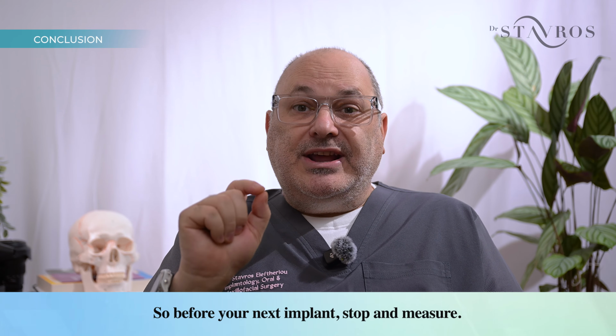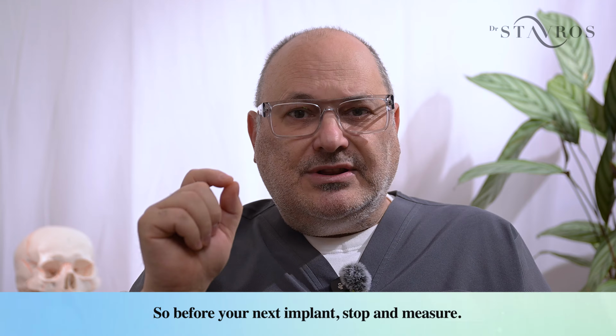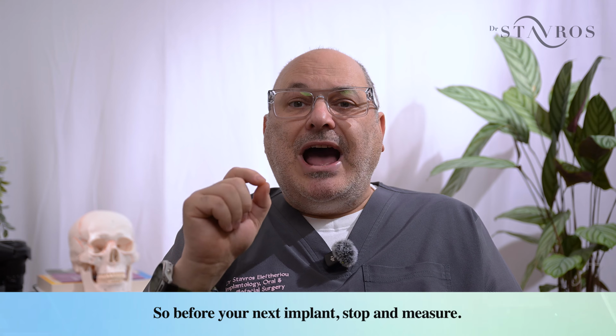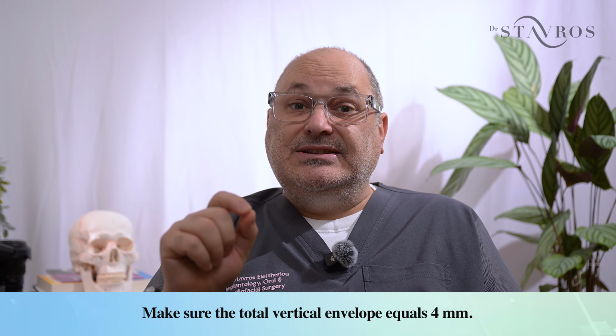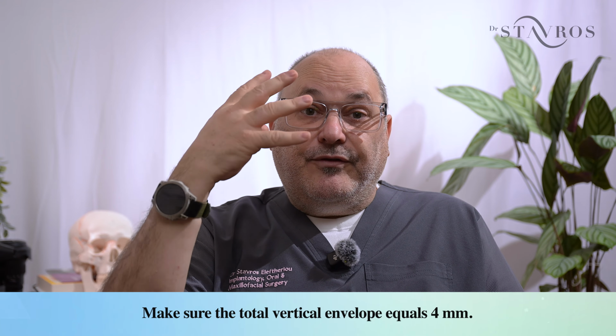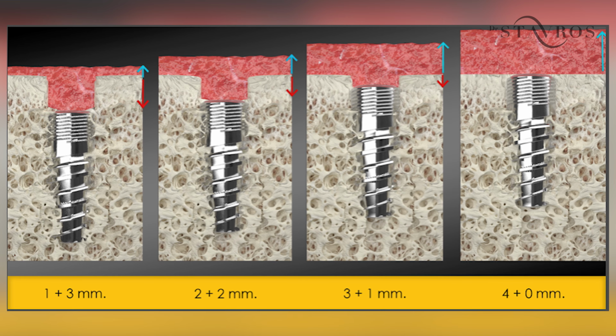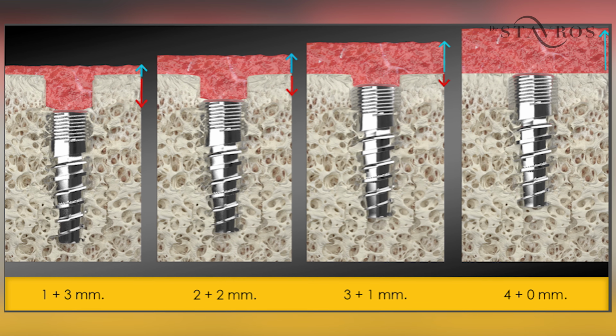So before your next implant, stop and measure. Check the mucosal thickness. Calculate how deep your platform must sit so that the total vertical envelope equals 4 millimeters. When you respect that number, bone doesn't move. Biology is satisfied. Measure tissue, set implant depth, protect bone. Because long-term stability begins where biology feels at home.